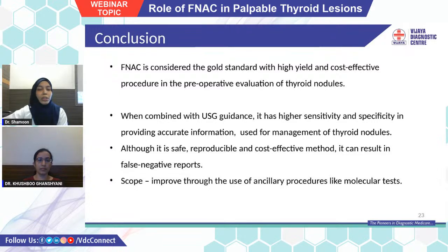Coming to the conclusion of my topic, FNAC is considered the gold standard, with high yield and cost effective procedure in pre-operative evaluation of thyroid nodules. Mind you, in pre-operative, because in post-operative cases, histopathological examination is the gold standard. And when it is combined with ultrasound guidance, it has higher sensitivity and specificity in providing accurate information, which can be used for management of thyroid nodules.